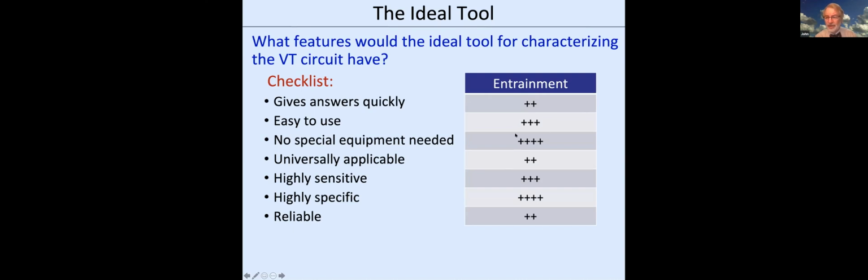You don't need any special equipment. You need a stimulator. Everybody's got that, and a catheter in your hand and some recording equipment. It's not universally applicable, as I said, because you have to have tachycardia that's reasonably well tolerated. It's pretty sensitive. It is very specific. I don't know that there are tools that are much better than this, and it's pretty reliable if you use it correctly.